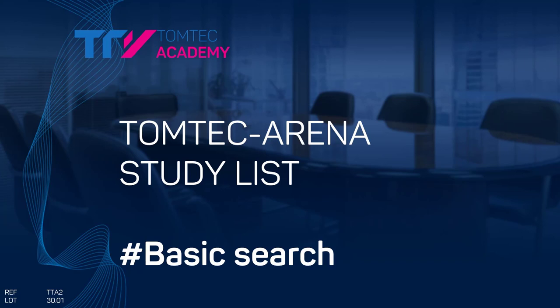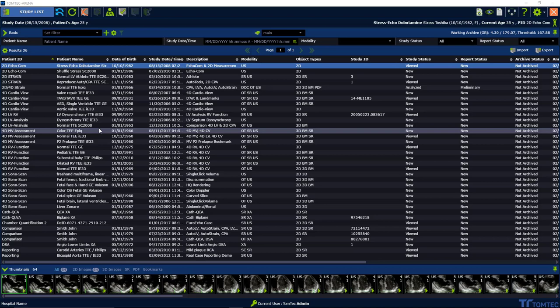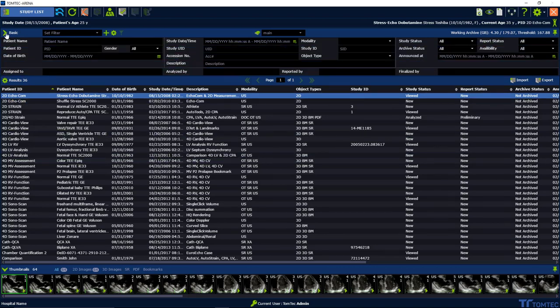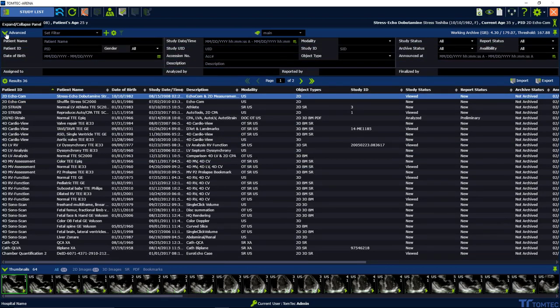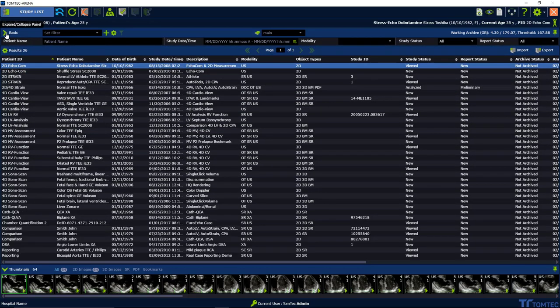How to use the basic search functionality in TOMTEC Data Center? Select the Expand/Collapse panel in order to change between basic and advanced search.